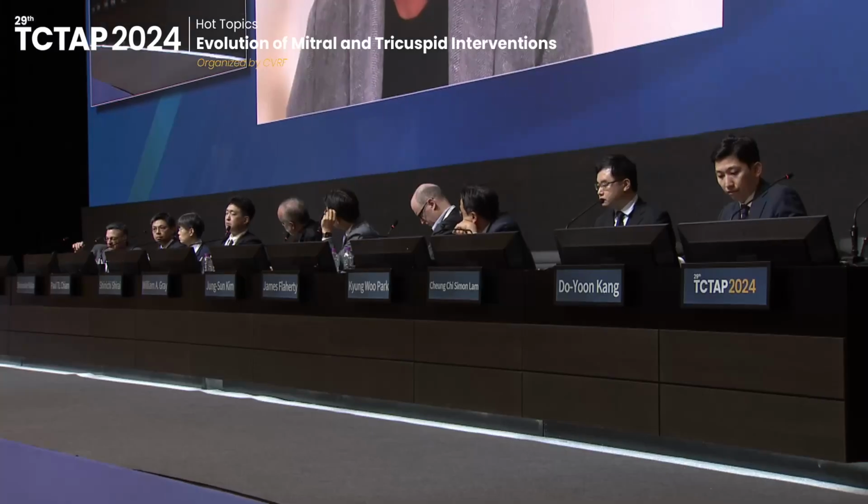I mean, the KCCQ improvements you showed, David, if you talk about heart failure, just plain old LV heart failure interventions, those are significant. Yeah, the benefit seen with TRILUMINATE, a 10-point absolute difference, is absolutely meaningful. The difference seen in Evoke was a little bit larger, almost 15 points, because they started out a bit sicker, actually, in terms of their KCCQ scores.